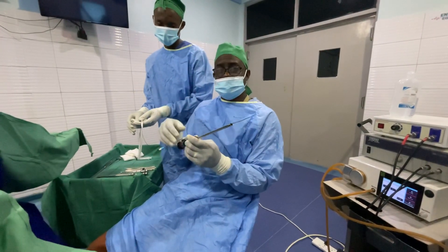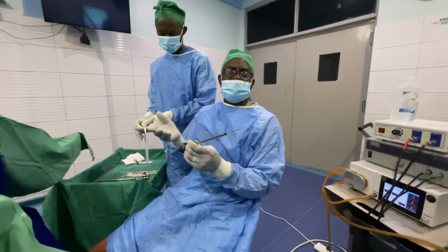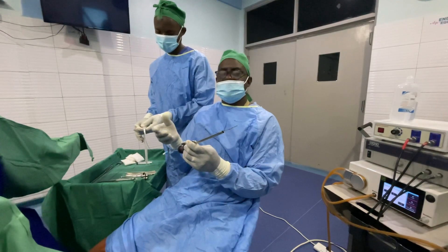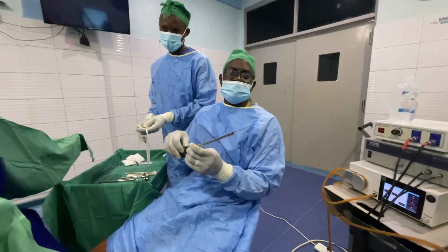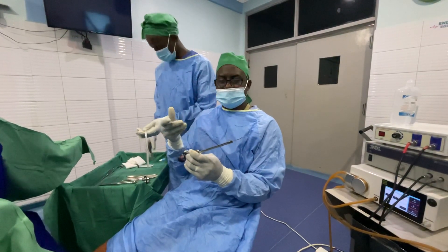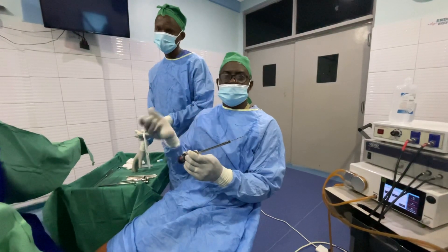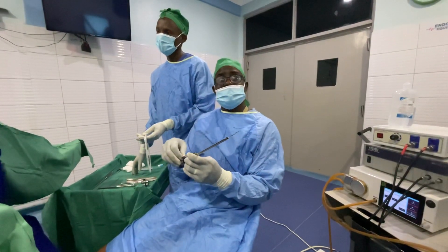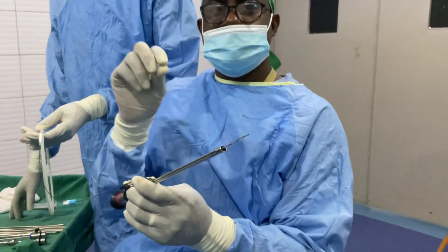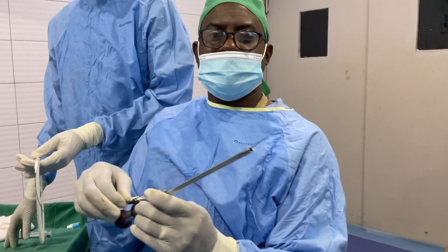The reason to cannulate the tubes individually is because it is better to appreciate which tube has a problem compared to introducing a dye directly into the endometrial cavity. You can also remove debris — for example, if you have tubal blockage at the ostia, especially following a previous evaluation or previous infection. Sometimes these patients have small debris at the ostia, and you can dislodge the debris using a tubo-cannula.